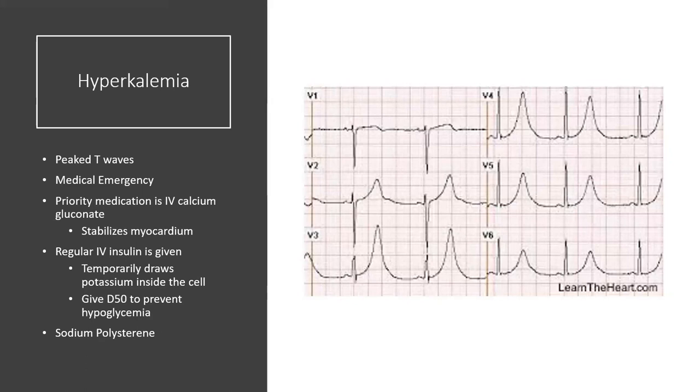So this is your hyperkalemia. You'll see peaked T waves. If you've got a patient who has way too much potassium, one way you can look at it is through the heart. It is considered a medical emergency.